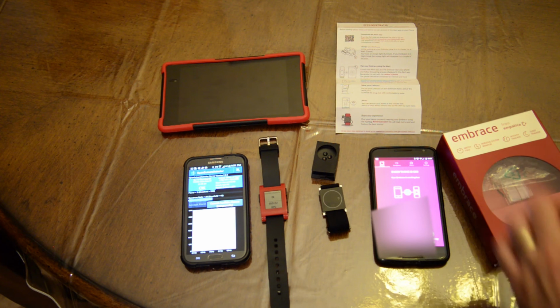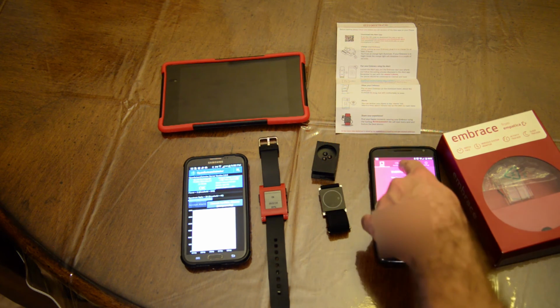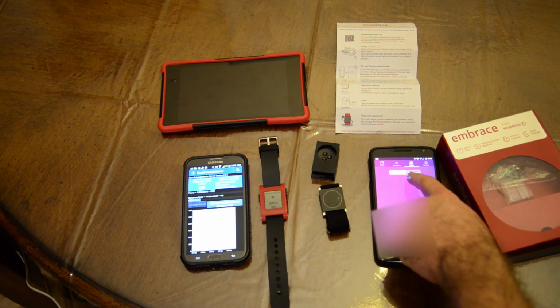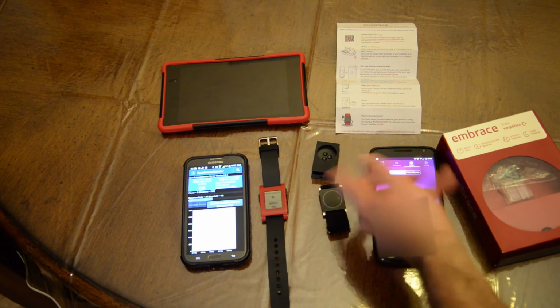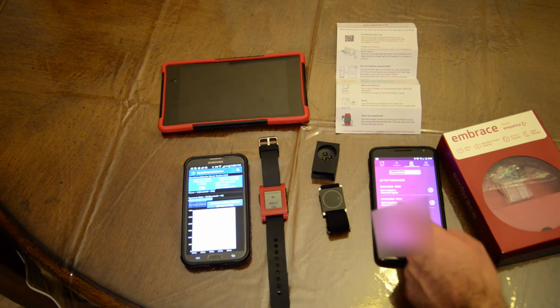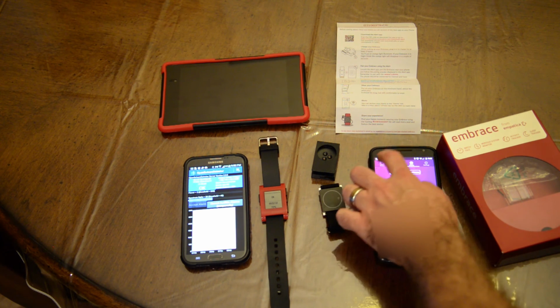Fortunately, it did call us, and you're going to get a nice little computer voice telling you that your son or daughter, and it'll give it by name, needs to be checked up on because they might be having a seizure. If it is a seizure, you will leave it in the recent alerts. If it was a false positive, you just hit the event here, select false positive, or false alarm, and it will put it up to here. As you can see here, the date and time will be given right here.